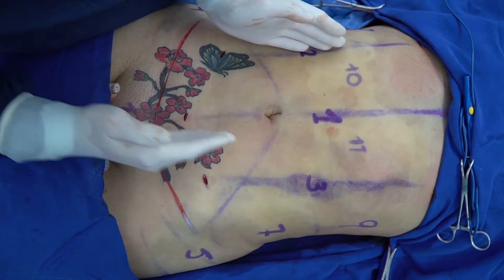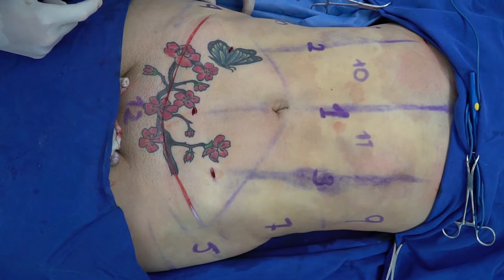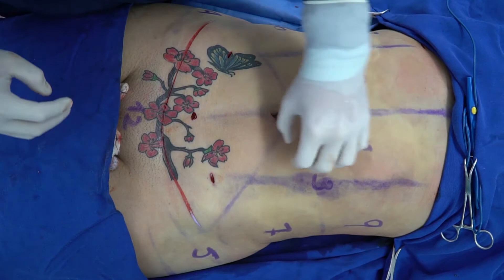First we do the midline and then we do the lateral lines, the lateral borders of the rectus muscle. We do deep and superficial liposuction in these areas, and after that we do the liposuction in the rest of the areas — in the lateral abdomen, in the central abdomen, and in the pubic area.